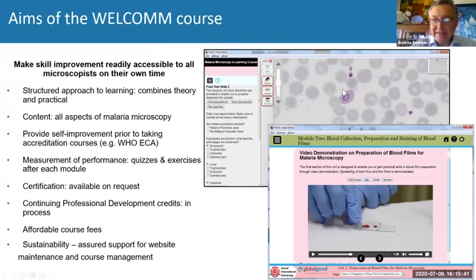It's possible to see a very nice image. This is a vivax parasite. And then to use the arrow keys up and down like you are moving the micrometer of the microscope to put the image in focus. So there are also demonstration videos, and there is a sort of pre and post test. At the end, if the participants are good, they get a certificate.